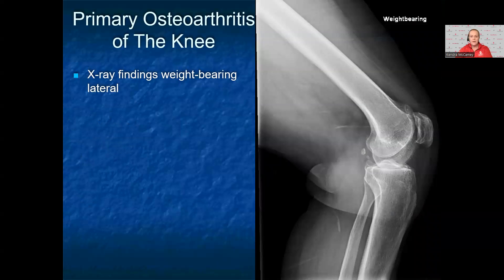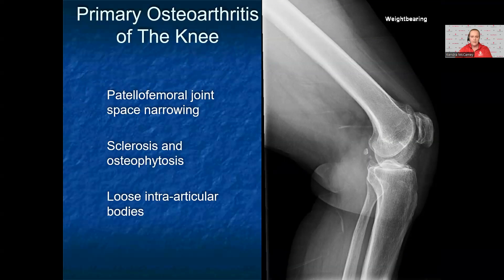Here is a lateral x-ray in a patient with the same history — note this is not the same patient as the last x-ray. This lateral weight-bearing x-ray shows degenerative changes of the patellofemoral joint space, identified by patellofemoral joint space narrowing, sclerosis, cystic changes, and osteophytes. The patient also has sclerosis of the medial joint line. There are also loose bodies in the joint. This is consistent with knee osteoarthritis.